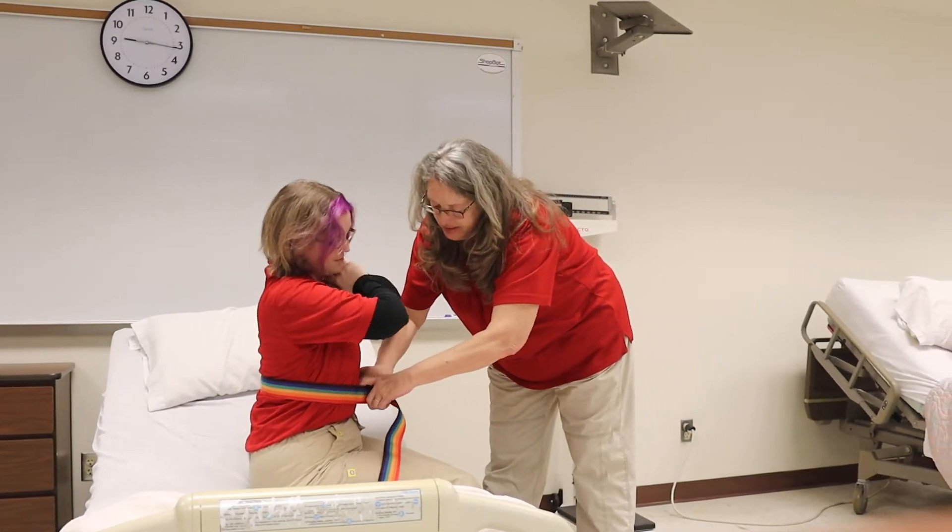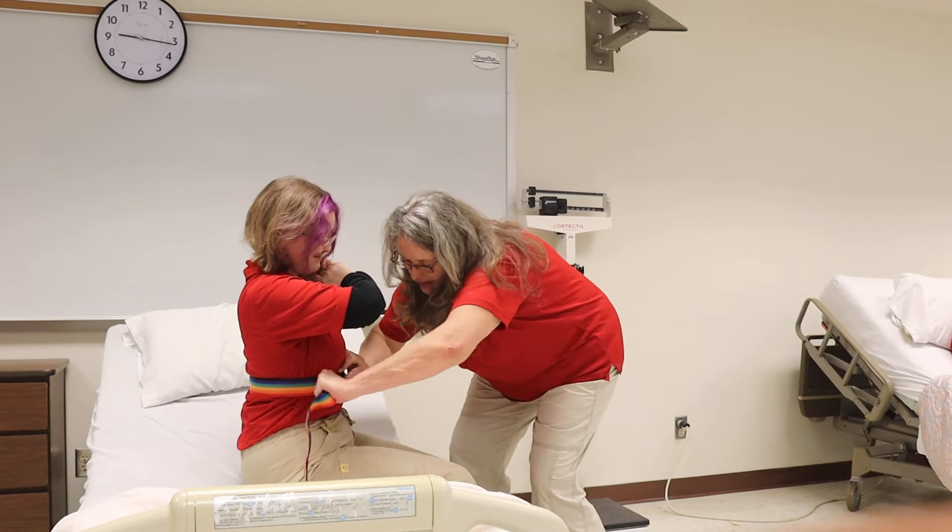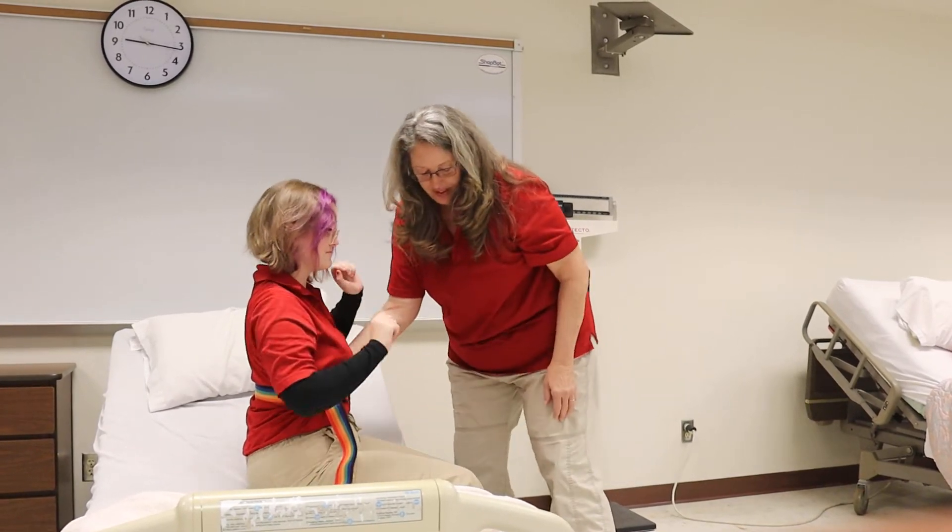You're going to apply the gait belt. Make sure it's snug — you can get the pads of your fingers under it.